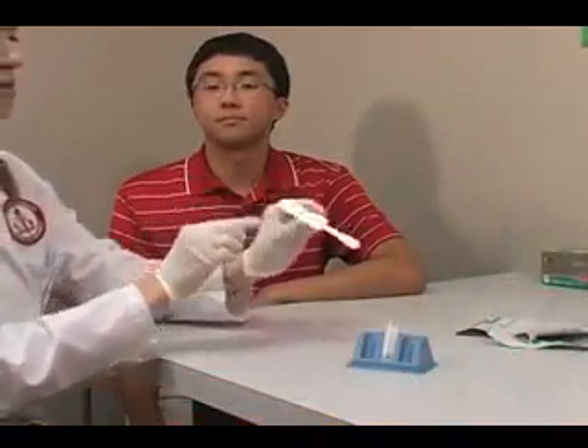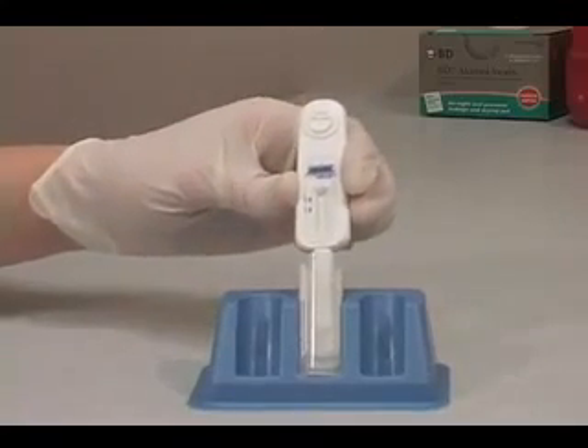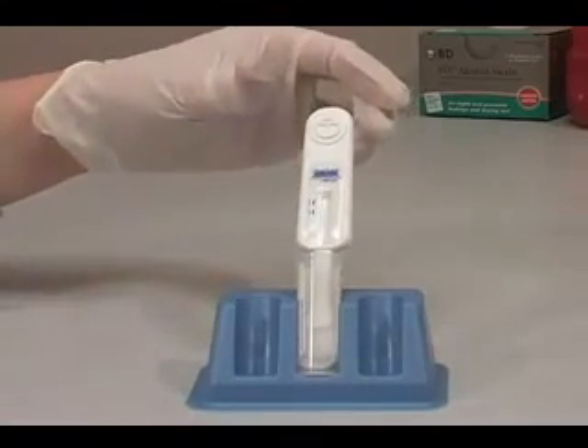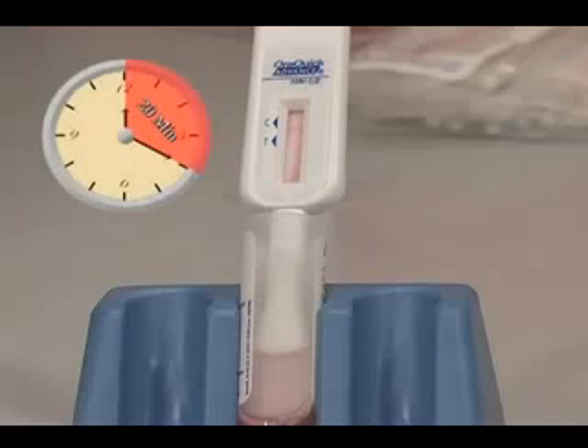The next step is to conduct the test. Insert the flat pad of the device all the way into the developer solution vial. Make sure the flat pad touches the bottom of the vial. The result window on the device should be facing towards you. Read the results after 20 minutes, but not more than 40 minutes, in a fully lighted area.